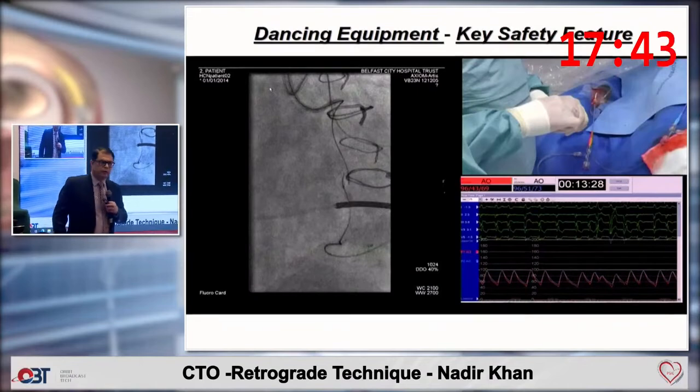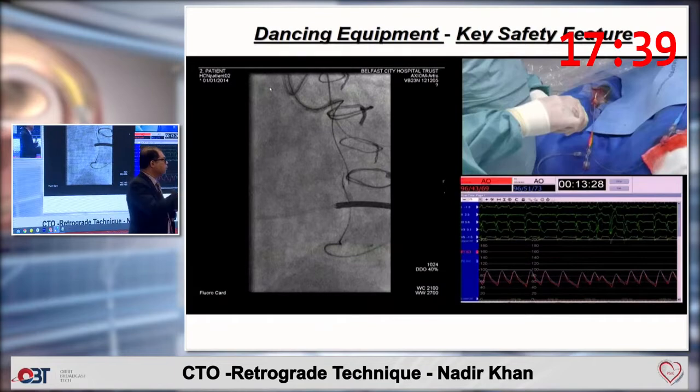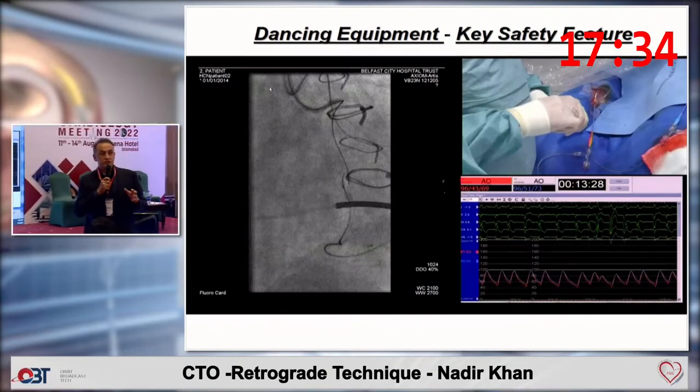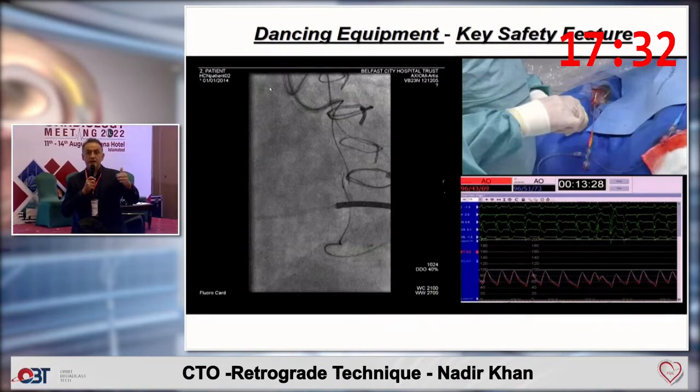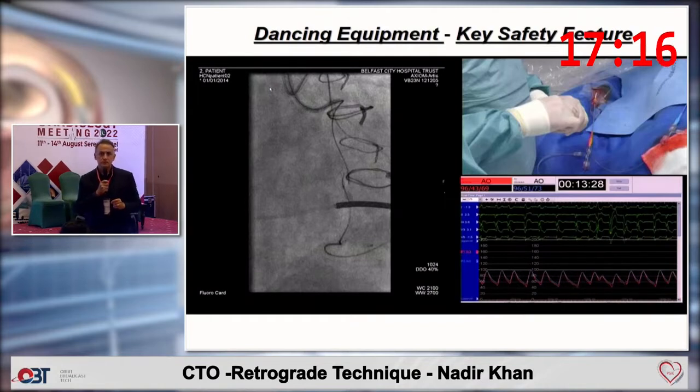Yes, that is a good point. Using the vein graft as a conduit, yes. Very good point. Especially if you have a very degenerated vein graft, it's very good collateral. It's easy to cross. If you have an occluded one, that's also good. You can cross an occluded graft, not that difficultly. That's another option. Yes.